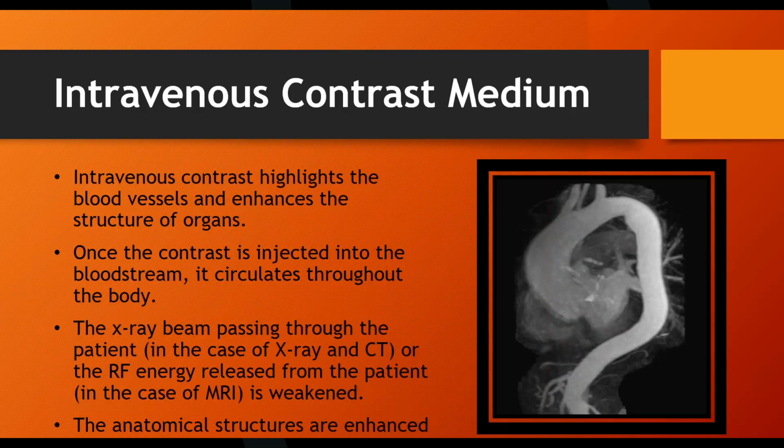Once the contrast is injected into the bloodstream, it circulates throughout the body, and that's another thing that the operators do have to keep in mind when they're doing this. They don't have to keep it in mind, but they're aware.